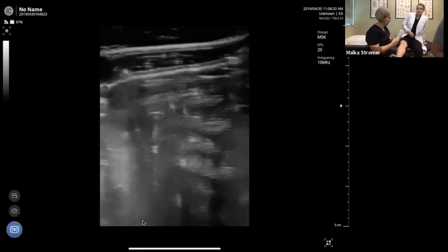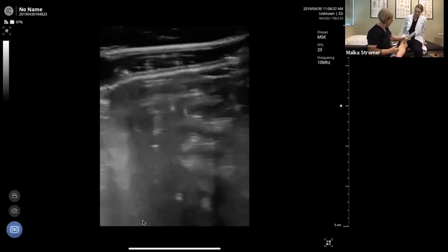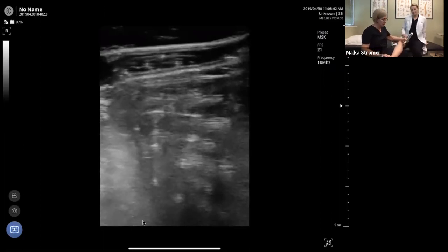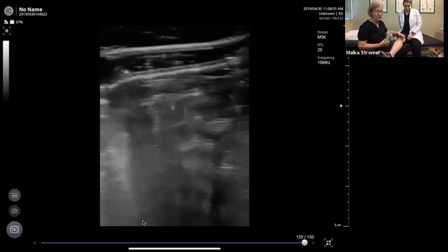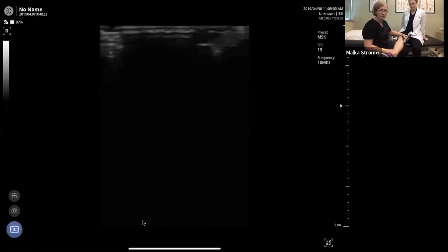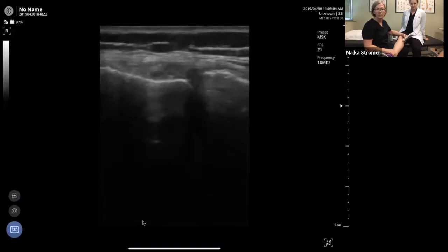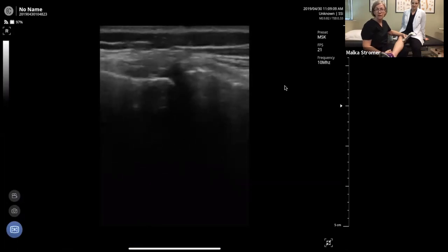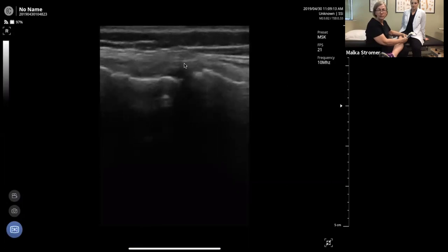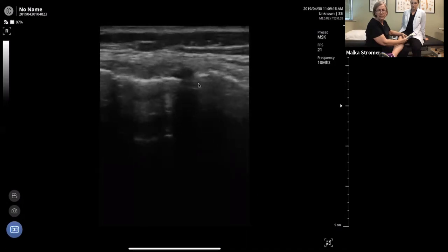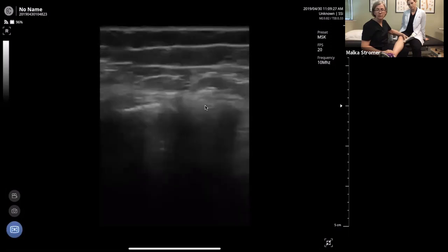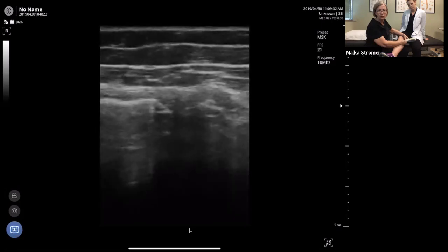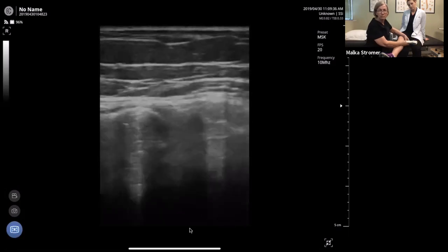Kira is an excellent patient and has no known knee issues. Starting medial to the knee — note that the joint is a little bit lower than what you think it is. Proximal is to the left of the screen, distal to the right. Medial joint is right in the middle. The first thing you're looking for is good joint space — there's a nice distance between her femur on the left and her tibia on the right. I'm scanning the medial collateral ligament from anterior to posterior with a scooping motion.